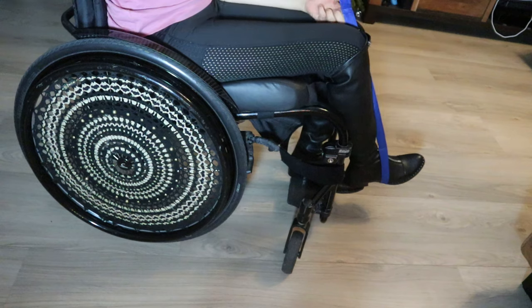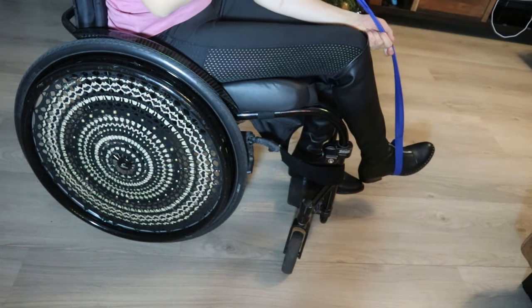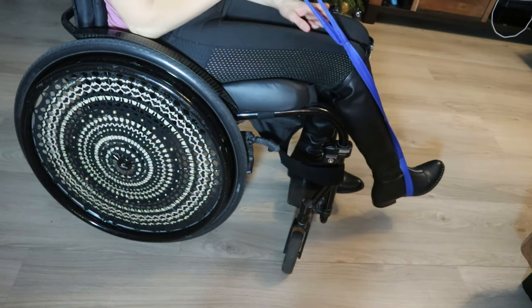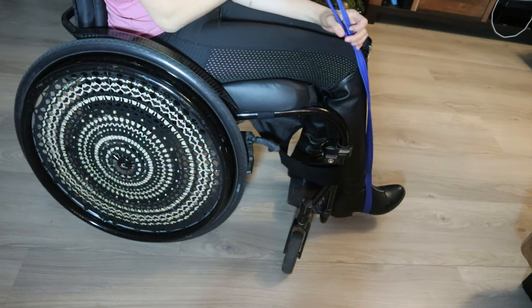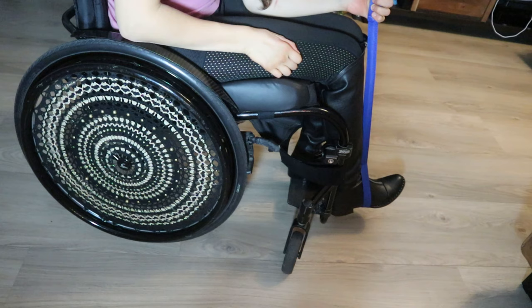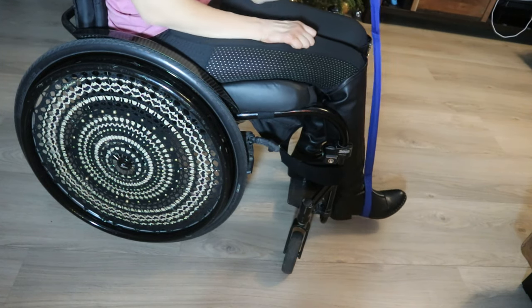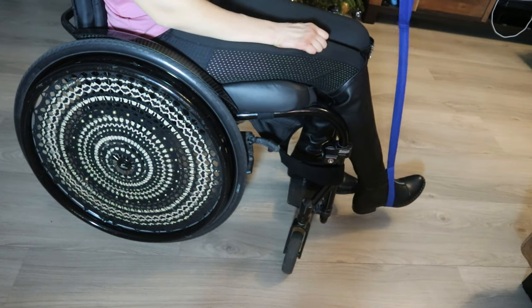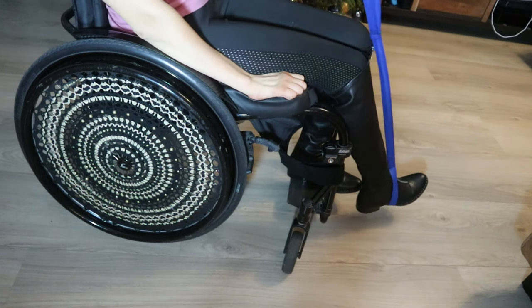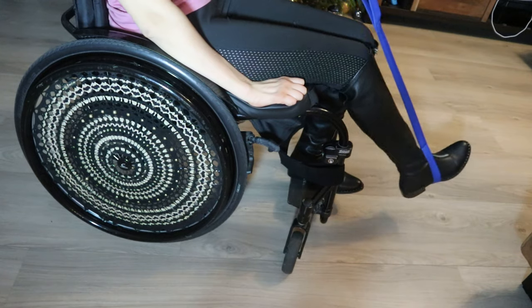If I can extend my leg with this thing, but I don't think so. Because the purpose that some of you recommended this to me was when I transferred into the handbike, to make it easier on putting my legs into the support. But I don't think... No. No.